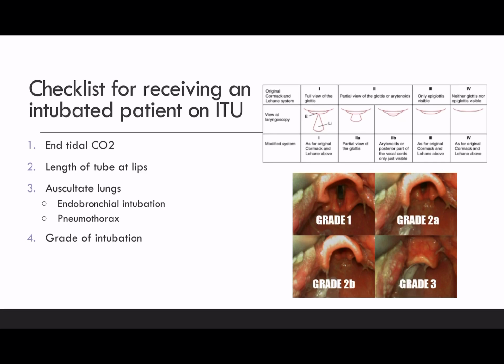Again, you'll only be able to confirm that through a combination of auscultation and chest radiograph, but it just increases the index of suspicion. You will be surprised how often these tubes move in and out during transfer, rolling of patients, coughing and so on, so always be cognizant of that length.